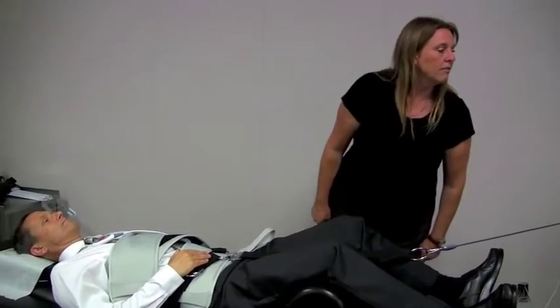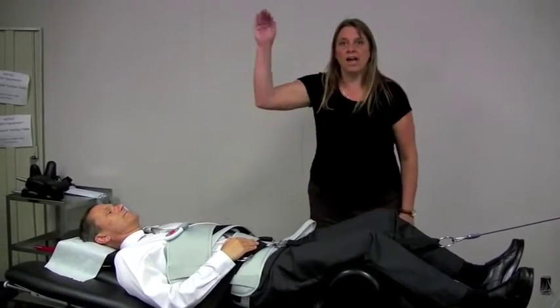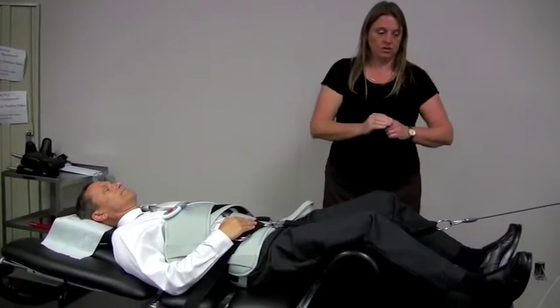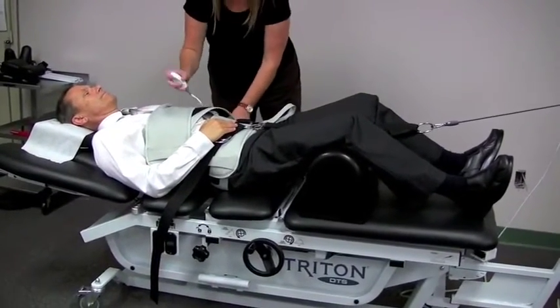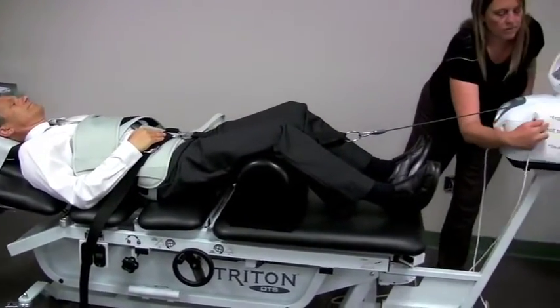And there we go. You have 8 pounds and about 10 seconds to go. If he had hit stop, it would have regressed rather instantly. It takes about a minute of regression. So it doesn't just go sprawling, it just lets you kind of regress slowly. So I'll take away this. Now you're down to 2 pounds. I'll just hook that right there.